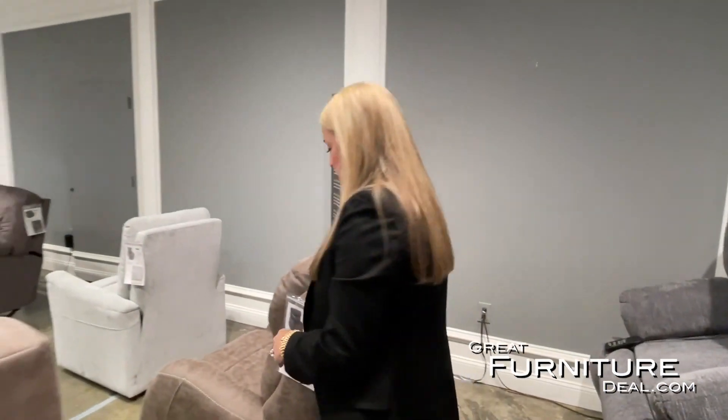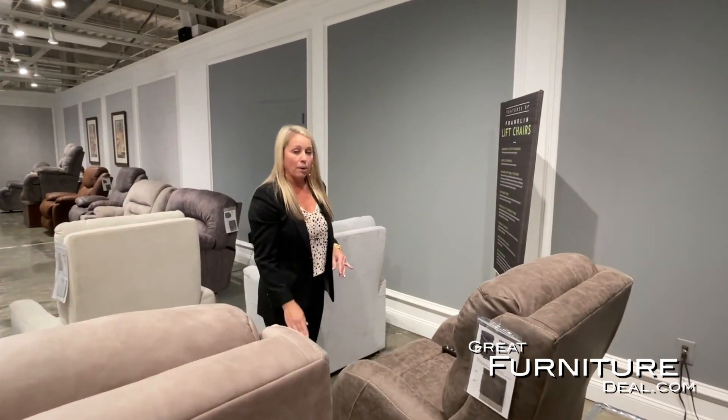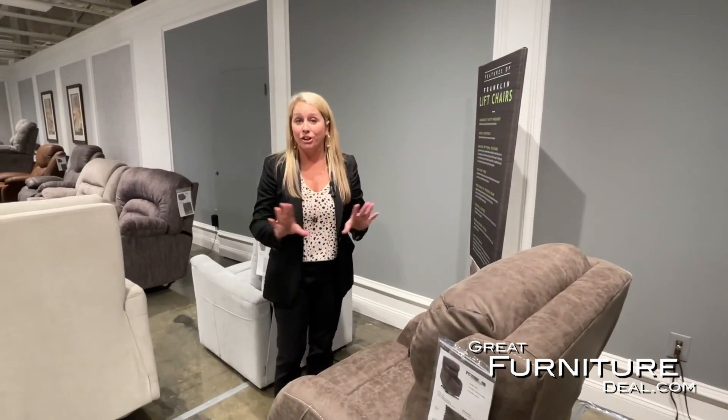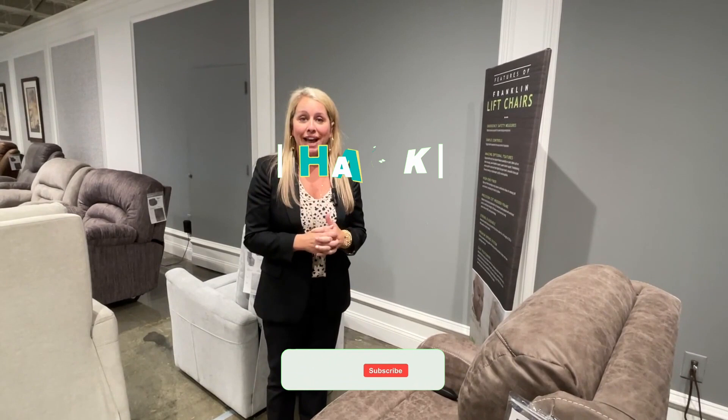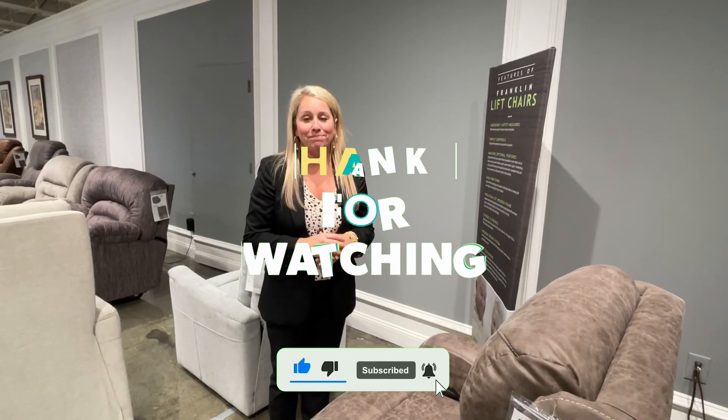Franklin lift chairs incorporate our premium spring system in all chairs for comfort, our WOW seating, our lifetime warranty foam seat core, and our virgin conjugate fiber in the backs. Franklin lift chairs are built to last and built for the customer that needs this assistance at home.